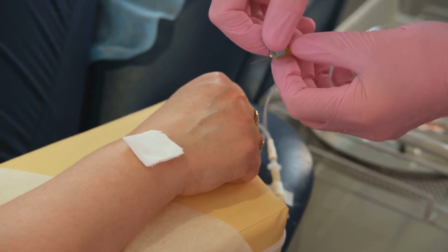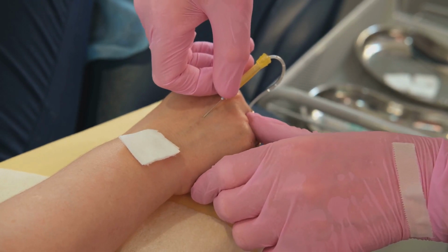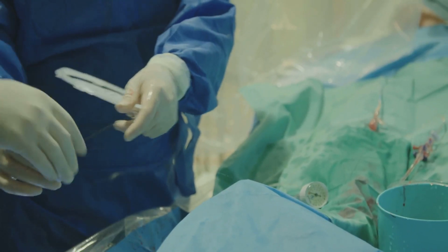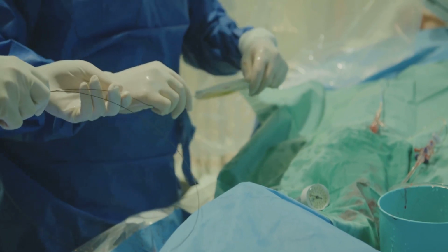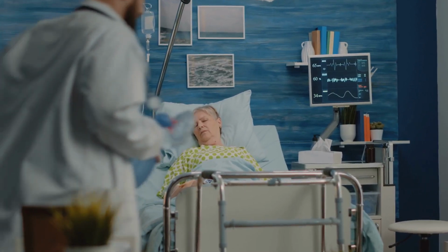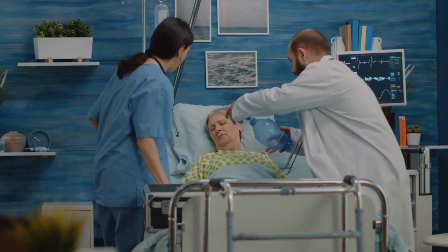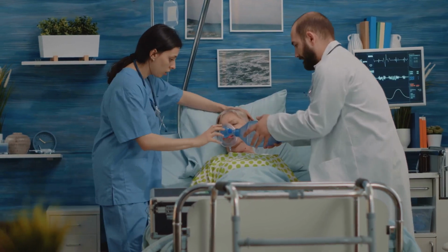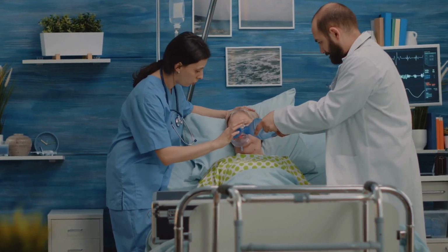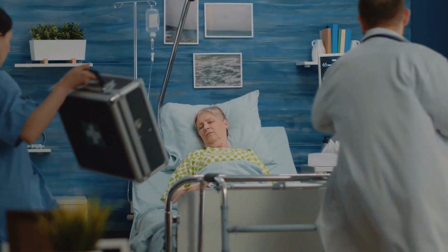It's also worth noting that catheter dislodgement can increase the workload for healthcare providers. Each time the catheter is dislodged, it needs to be reinserted, which takes time and resources. Additionally, dealing with the potential complications of dislodgement such as urinary tract infections or urethral trauma can further stretch already strained healthcare resources. However, there are methods to prevent and manage catheter dislodgement.